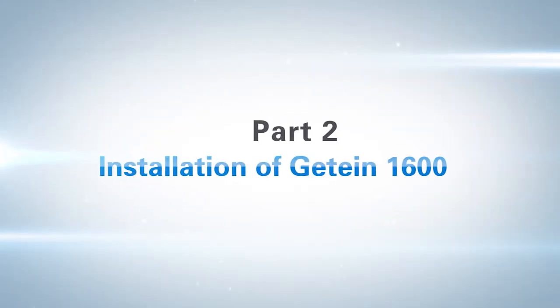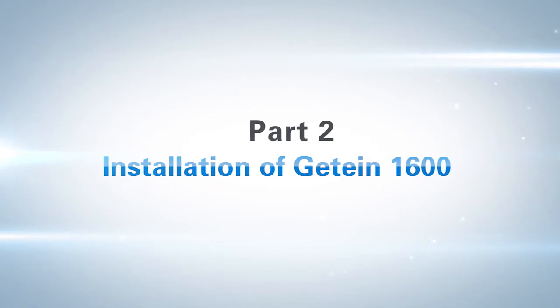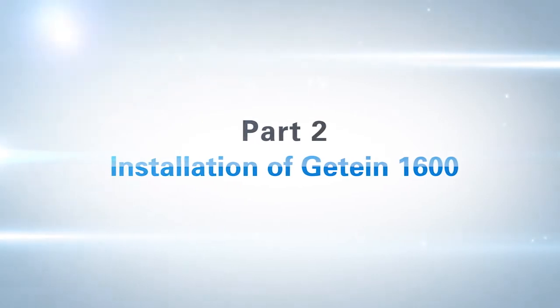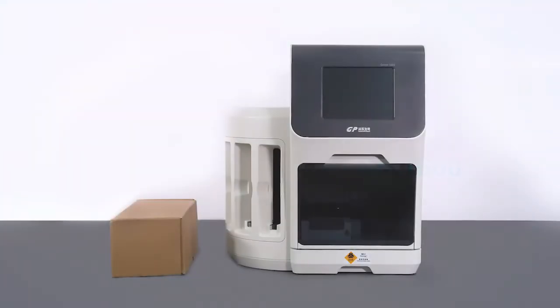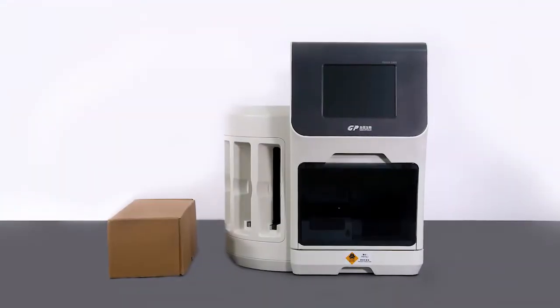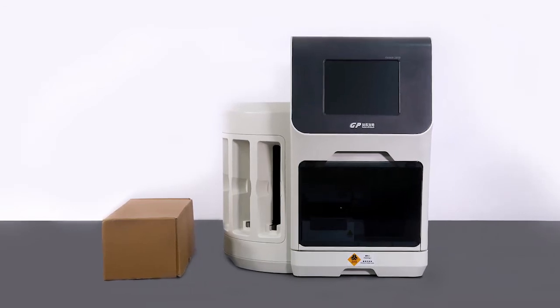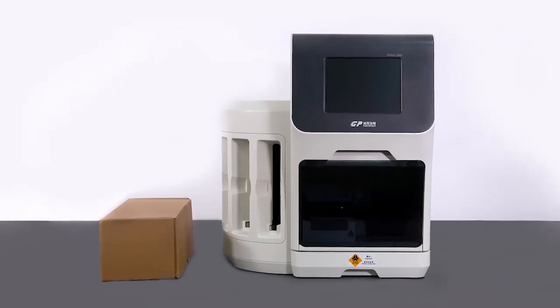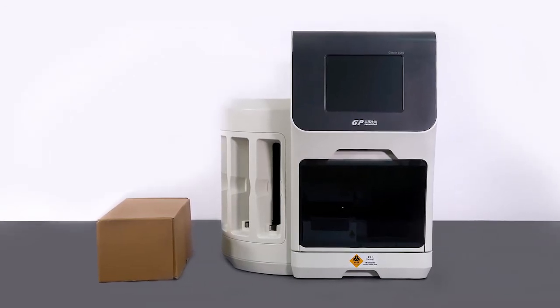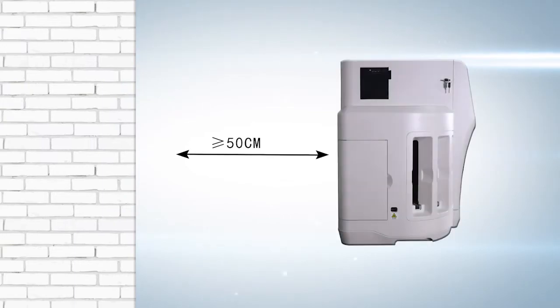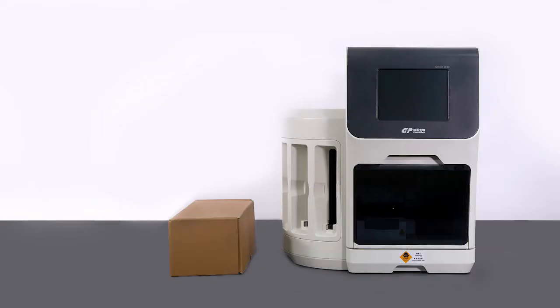Part 2: Installation of G10-1600. Place G10-1600 horizontally on an experimental table and ensure that the instrument is 50 cm away from the wall for enough working space.